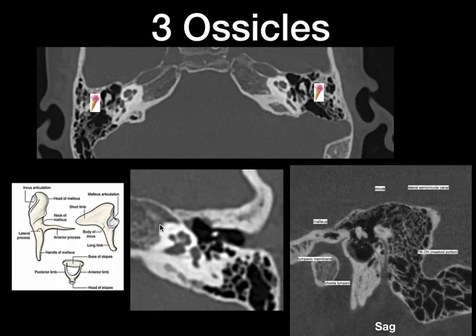First, coming to the three ossicles — the malleus, incus, and stapes. These are the three ossicles with their anatomical parts labelled. In the axial section you can remember the ossicles as the ice cream cone appearance, two dots, and two dashes. If you are seeing all three in different planes, it means the ossicles are intact and in place.